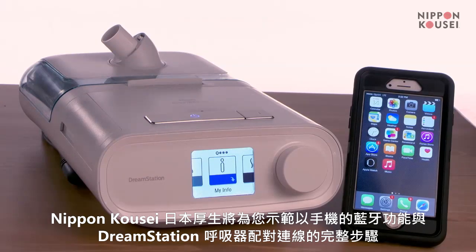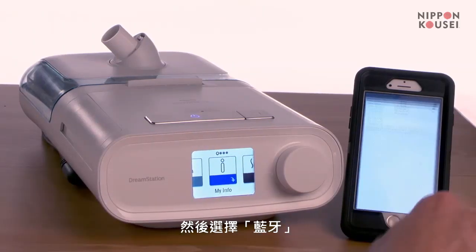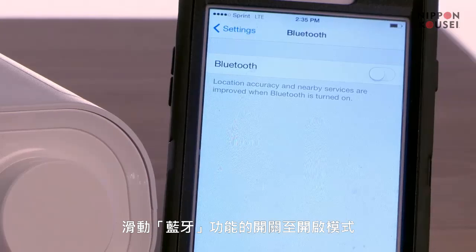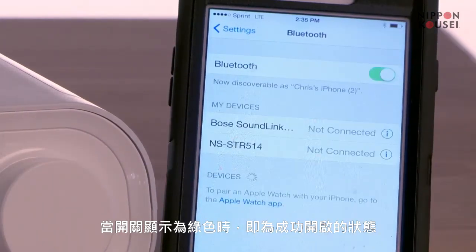This video will take you through the steps to pair your mobile device with your DreamStation sleep therapy system. The first step is to go into your phone's settings and select Bluetooth settings. Slide the button in the Bluetooth settings to the on position. You will know it's on when it turns green.